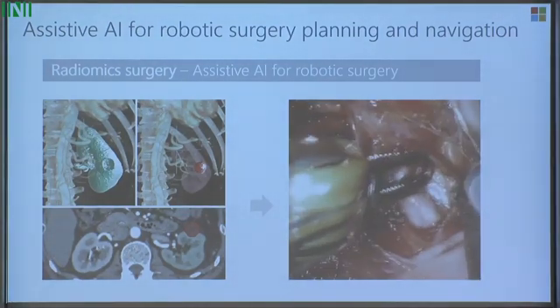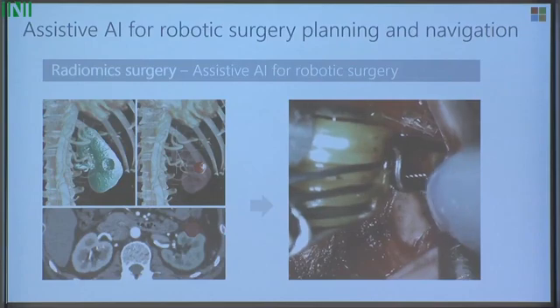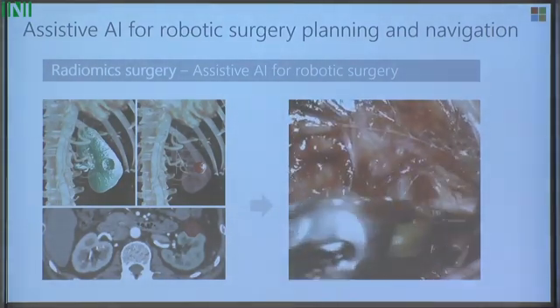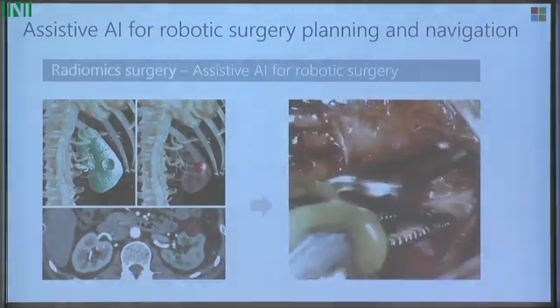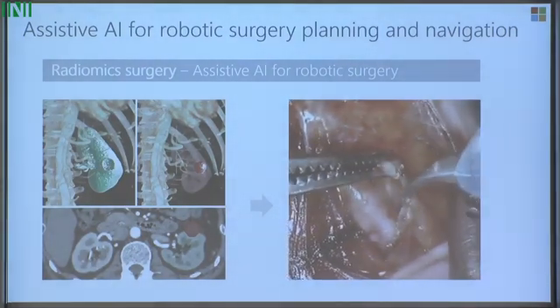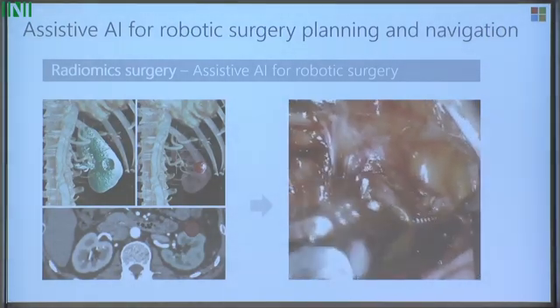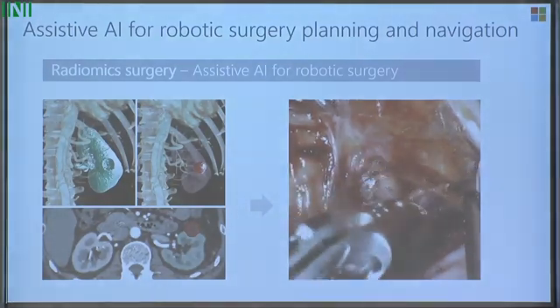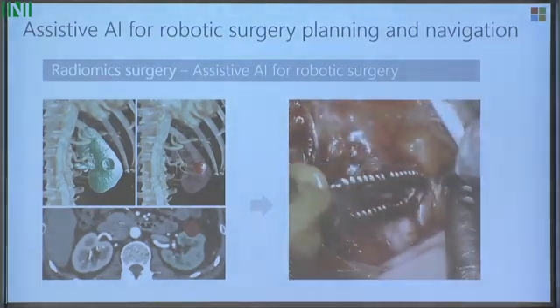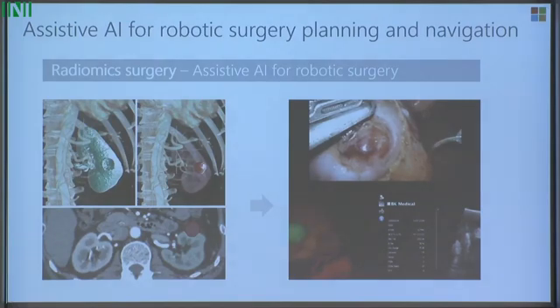Because they're removing the tumor from the kidney, what the surgeon also needs to identify in the course of the operation is which artery feeds into the tumor, so that using the robot they can clamp the artery to restrict blood flow, and this gives them 20 minutes to actually remove the tumor. So we worked with Intuitive Surgical to figure out how our algorithms can be integrated into their surgery pipeline.